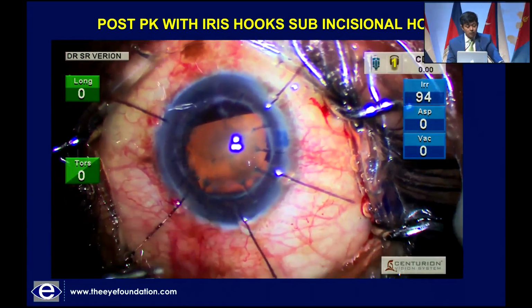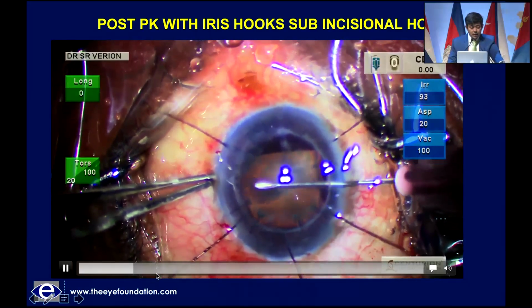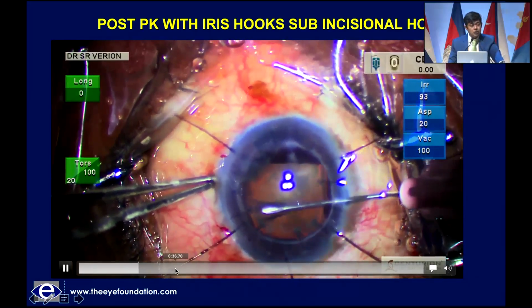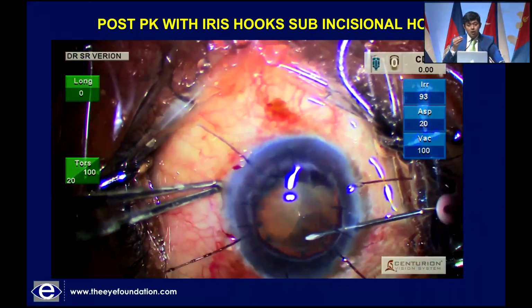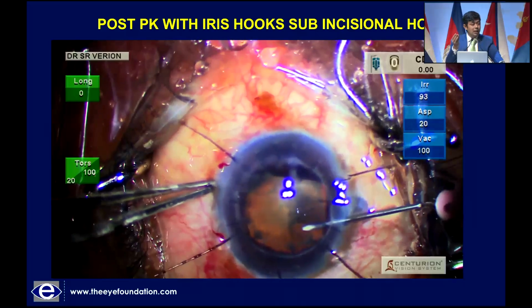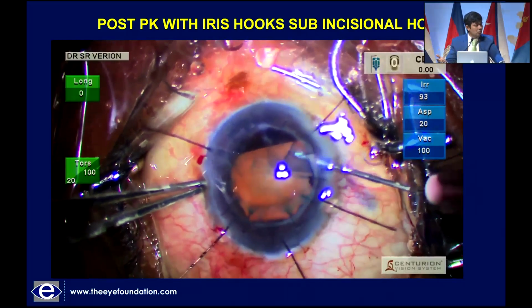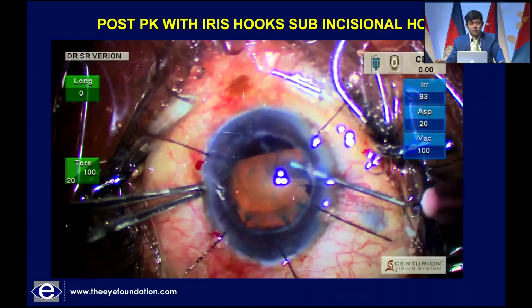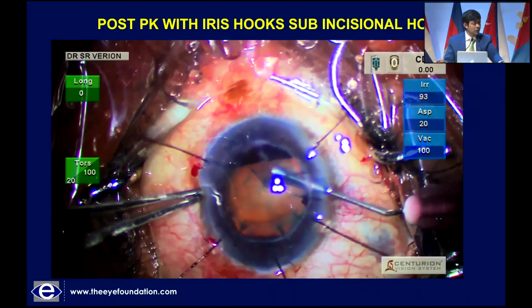Now, it's important that we follow good, safe principles of phacoemulsification, have iris hooks in place. Ensuring that the iris doesn't come into the wound is very, very important, because automatically in those cases, your phaco will become a little more anterior. That's reasonably okay in a patient with a normal cornea, because you'll just end up with a little bit of striate keratopathy. But in a graft like this, that will lead to the failure of the graft itself.